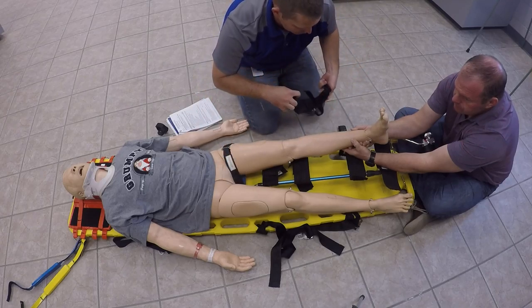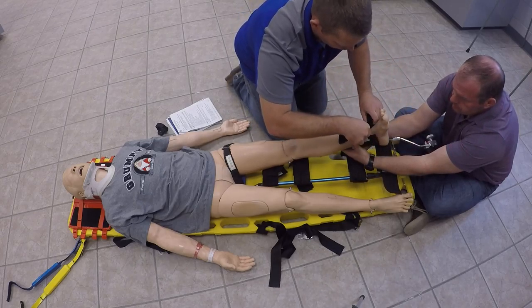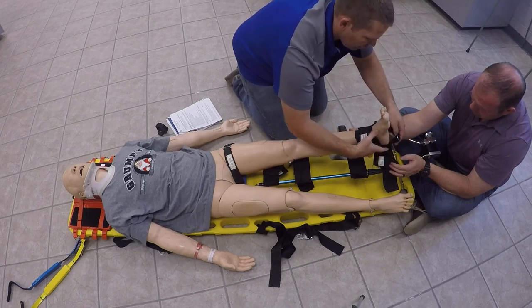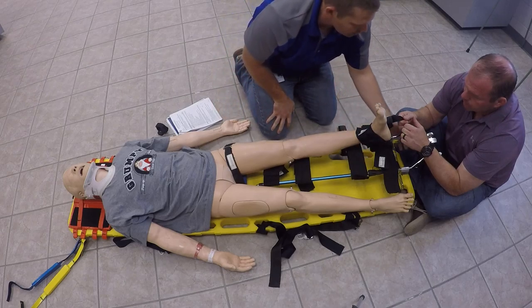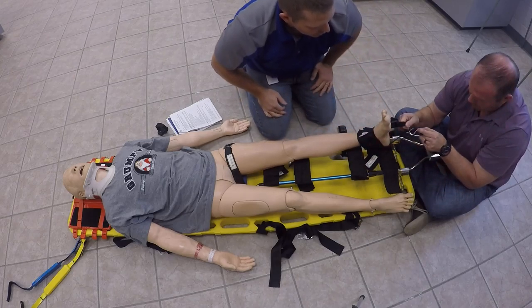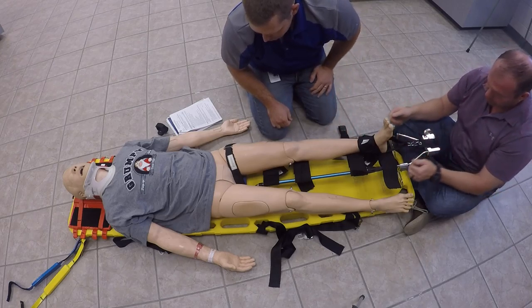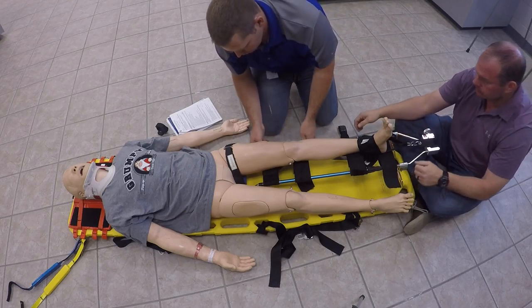Once that's in place, we'll go ahead and put our ankle hitch on. We want to make sure that we don't release traction during that process and that we're able to maintain it. Then you can go ahead and pull with that, and he maintains traction there. We'll go ahead and loosen this up and attach it in there, and then he can go ahead and apply mechanical traction. You'll just do it until the patient appears relieved of the pain, and then we can start putting all of our straps on.